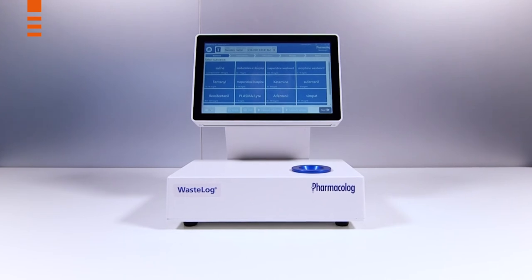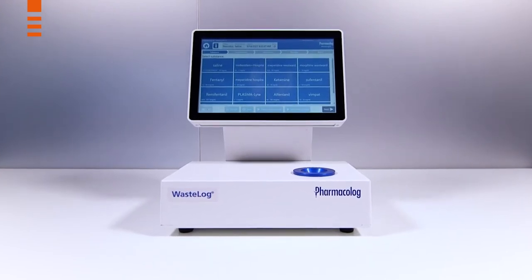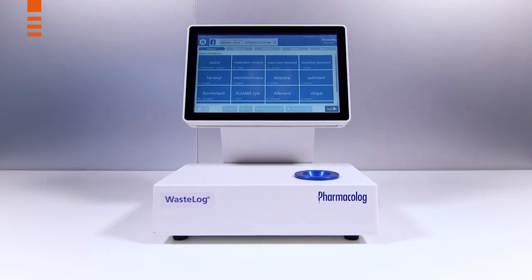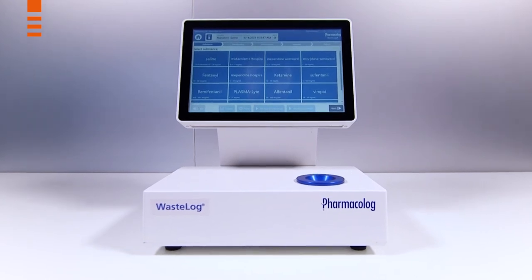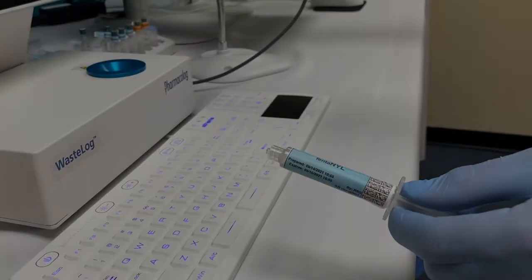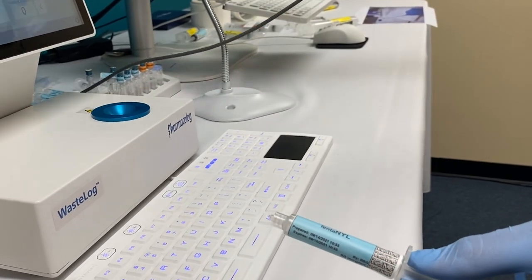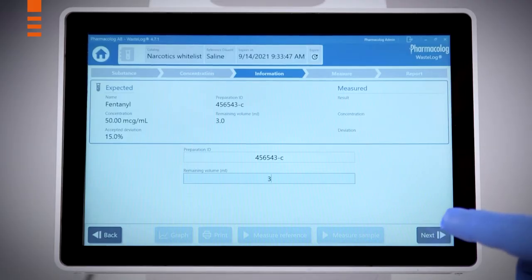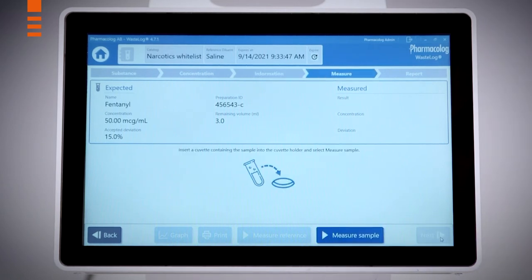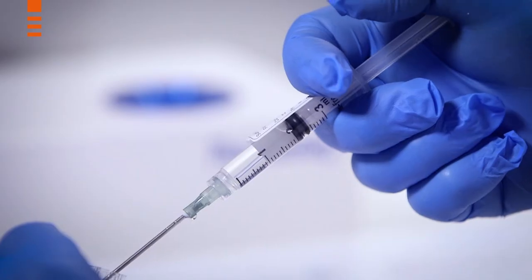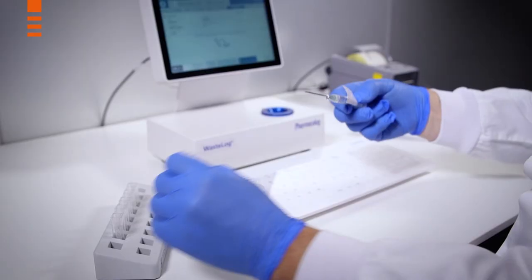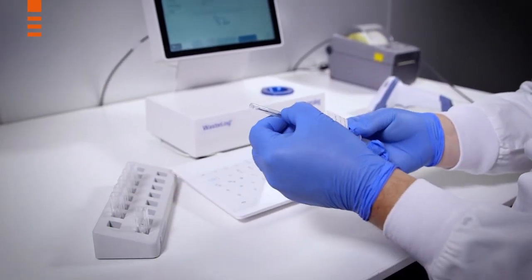WasteLog provides a simple and effective way to monitor and safeguard discarded or returned controlled substances. The expected substance and concentration are easy to scan. A small sample of the controlled substance is withdrawn and inserted into the WasteLog device.